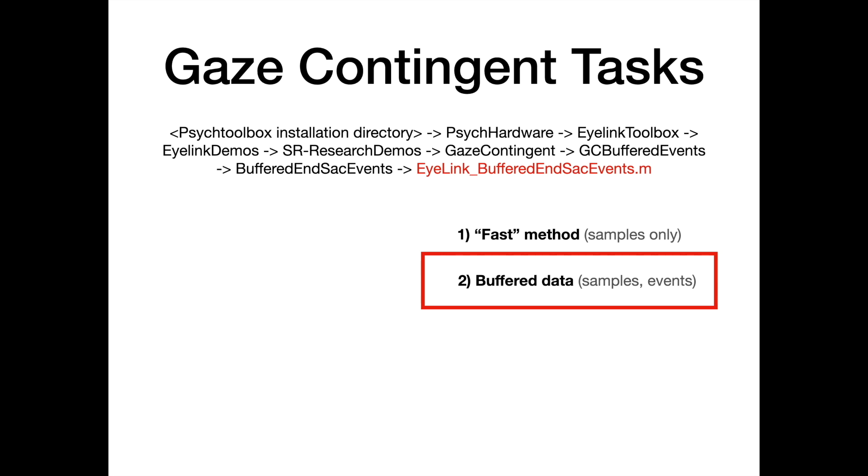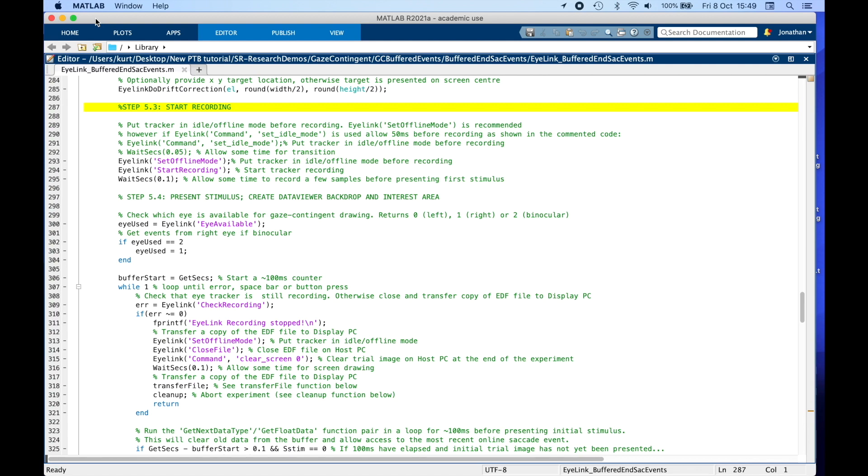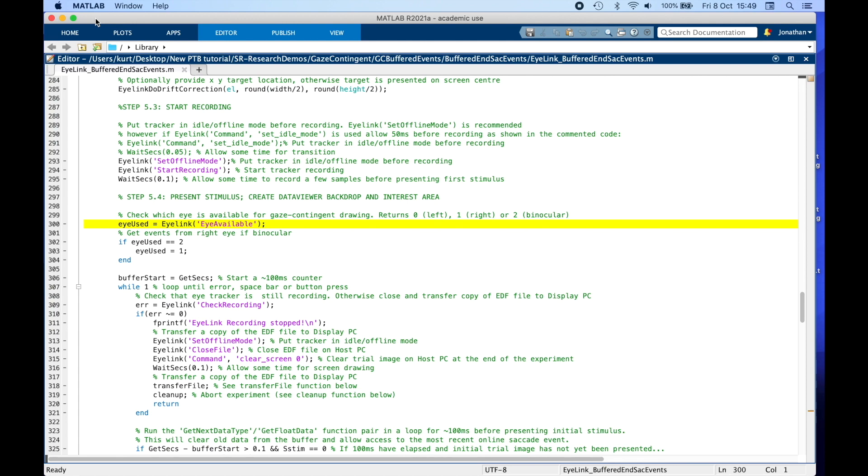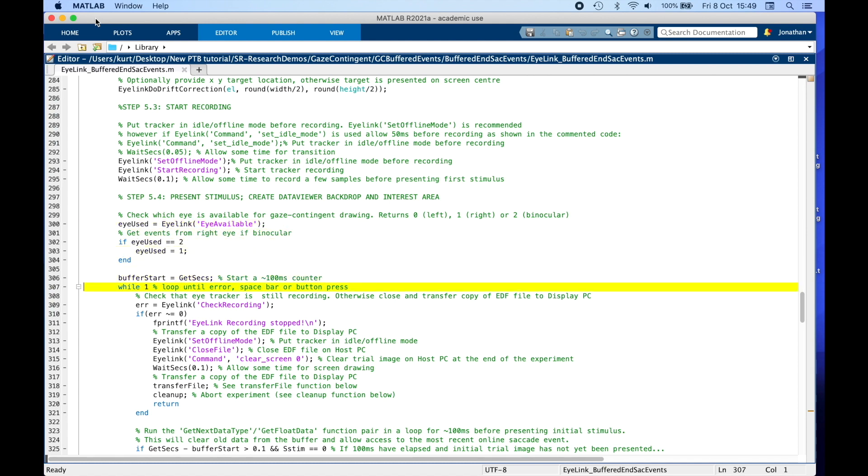So let's go through it. The relevant code starts from step 5.3 of the script. First, we start recording eye movement data. We check which eye is being recorded and update the eye used variable accordingly, same as we did in the previous task.